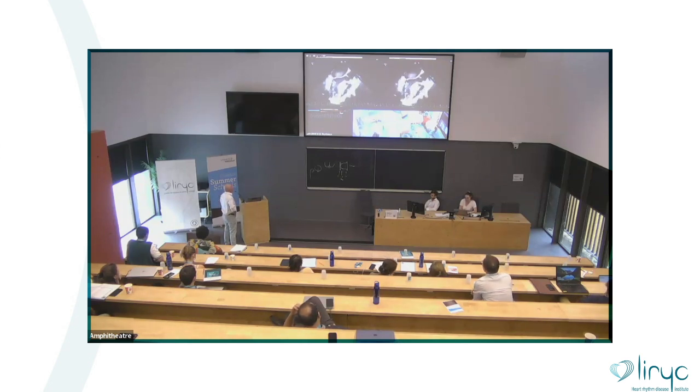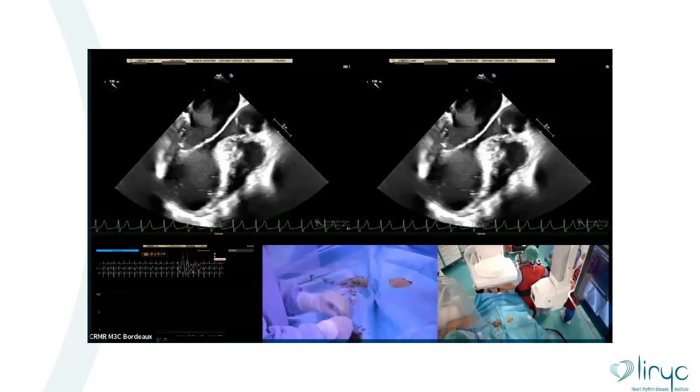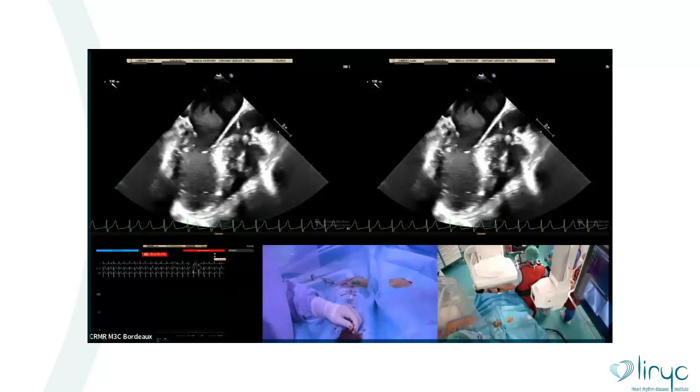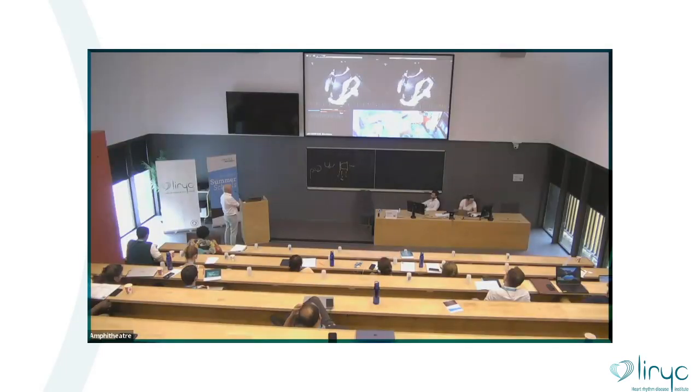Once the catheter is through the valve into the left ventricle, is it possible to have a longitudinal view of the catheter to be sure it's pointing towards the VSD? So you advise us to pull back the wire and see the angle of the catheter to make sure that it is correctly directed? Right. The difficulty of echo-guided procedures is the tip of the catheter. It's hard to see the tip, and you need to know where the tip is.